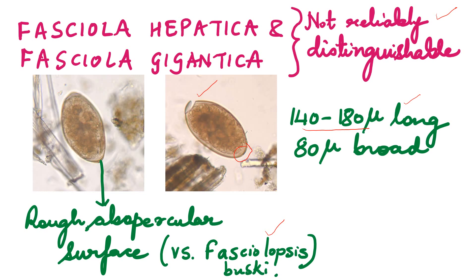It becomes very difficult to say this is Fasciolopsis buski or Fasciola hepatica or gigantica. In such cases, your diagnosis will depend upon what the patient is manifesting with — symptoms of the biliary tract or symptoms of the GI tract. Summary: Fasciola hepatica and gigantica produce big-sized eggs, 140 to 180 microns, operculated, with a rough or irregular ab-opercular end.